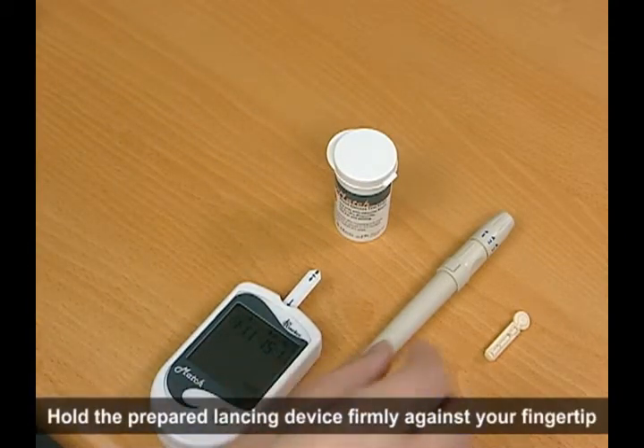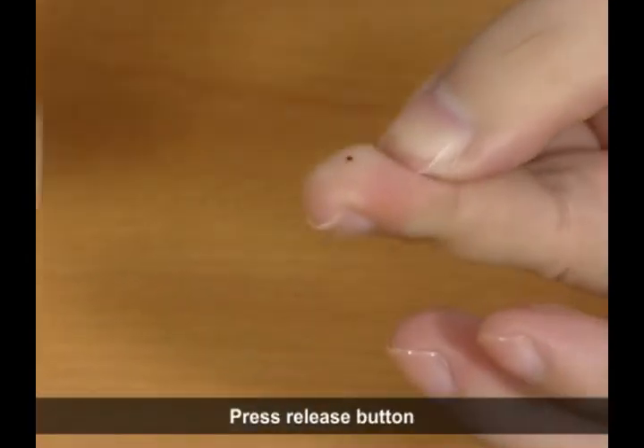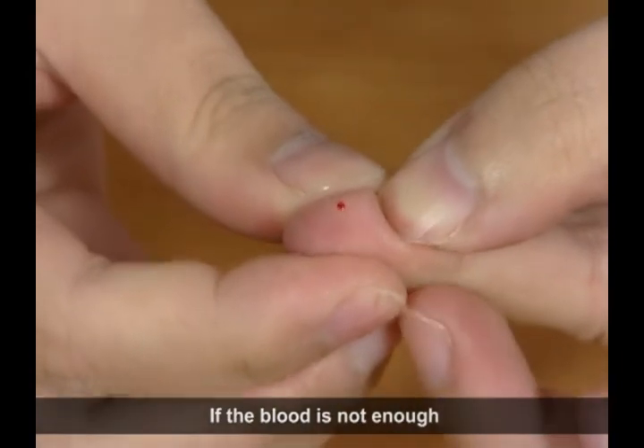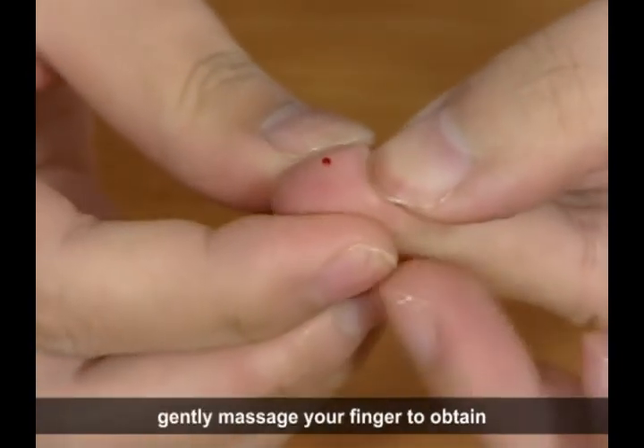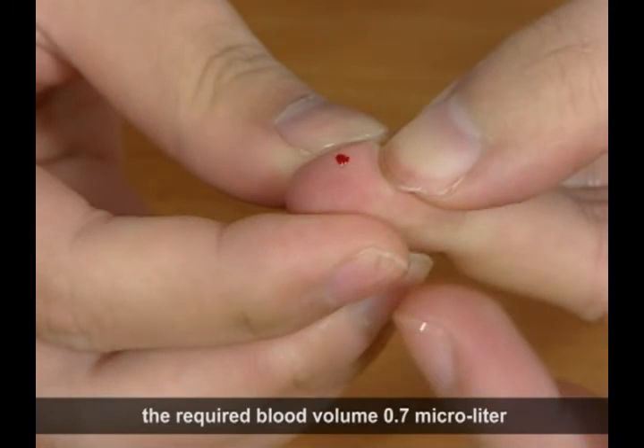Hold the prepared lancing device firmly against your fingertip and press the release button. If the blood is not enough, gently massage your finger to obtain the required blood volume of 0.7 µL.